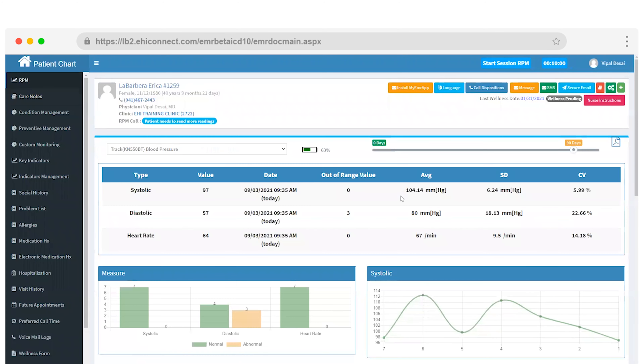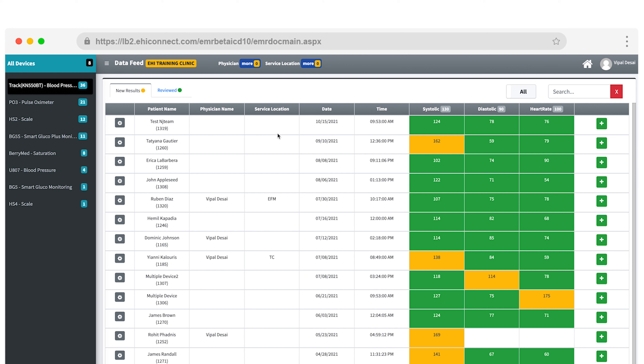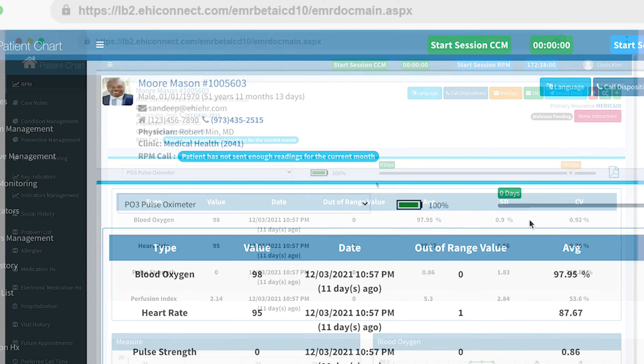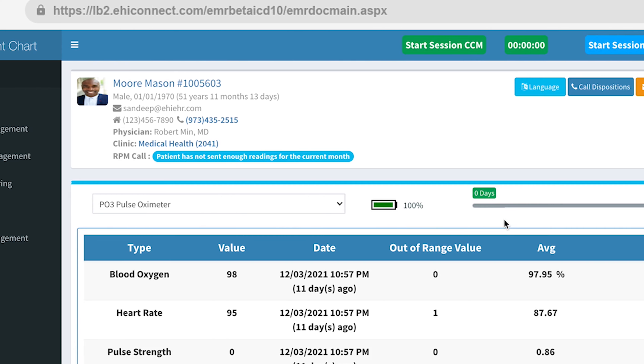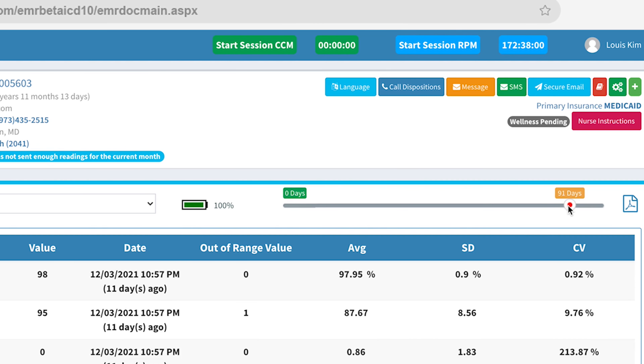Once your patients start taking their daily readings, our application comes to life. You'll see all that data visualized for every individual patient as well as your entire patient population. In your patient's chart, you'll be able to see an overview of your patient's daily readings. You can see which device they're enrolled with, the battery life of that device, and you can adjust the slider to view their readings anywhere from a day to 90 days.